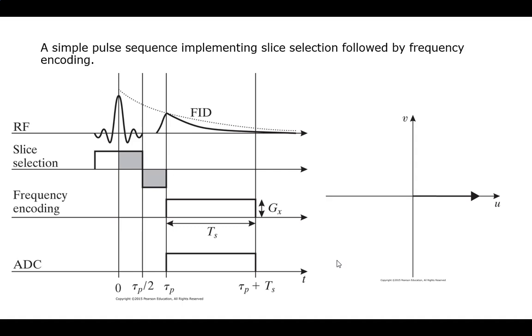If you're wondering why there was no Y perturbation, it's because I was measuring Y equals 0. That's why it's a simple one. It doesn't involve any adjustment or encoding on that. It literally just reads straight down. Okay? And so all I'm doing with this.